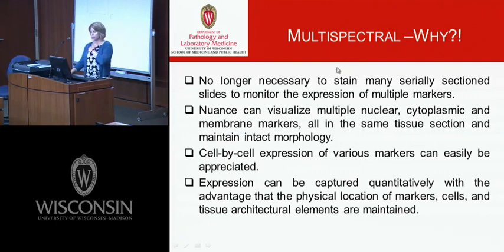So again, multispectral, not multiplexing, but multispectral. Why would you want to do that? So as I had indicated previously, investigators used to stain serial sections, one section with one marker, the next section with the next marker, and try and line those up and get a spatial relationship.